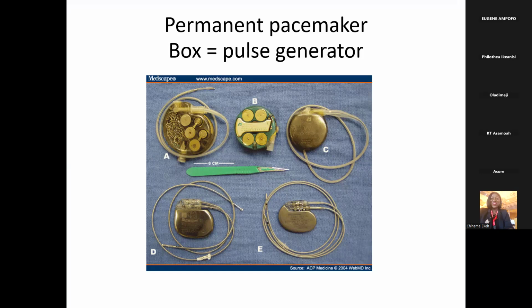As I said, the modification of pacemakers moved from very big batteries to bullet-sized batteries. One important thing we should know is that the common pacemakers would have the can, that's the battery, and the header, that's usually the latest ones they make. So the battery, the header that has the two ports for fixing the electrodes, and we have the leads, which are also called the electrodes.